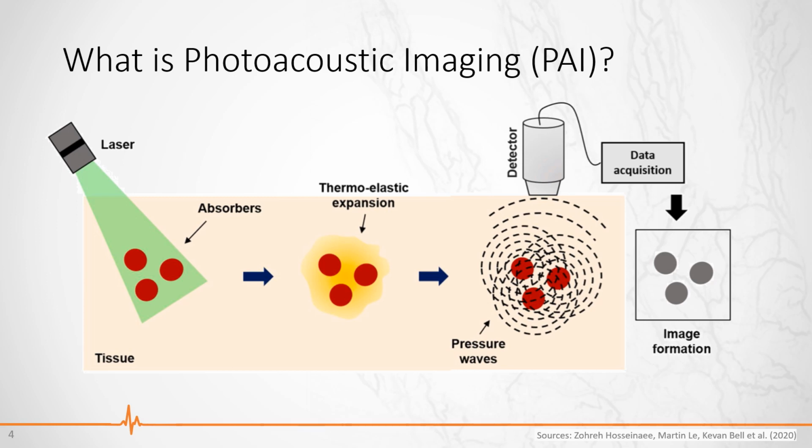This mixture of optical and acoustic measurement has some great advantages. First, high contrast, since the detected signal is exactly emitted by the structure of interest and not backscattered from everywhere like with conventional ultrasonic devices. Second, the method is much more robust against diffusion of light compared to optical-only imaging, because the light does not need to be perfectly focused here, and it crosses the tissue only once. Therefore, we can achieve greater imaging depths.